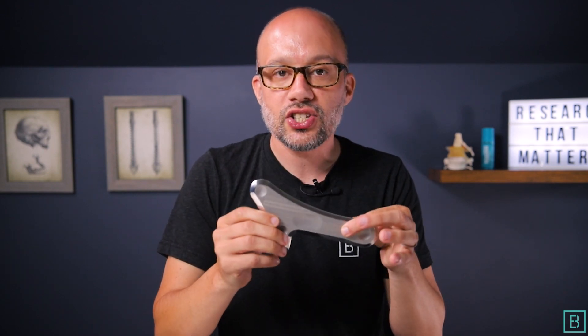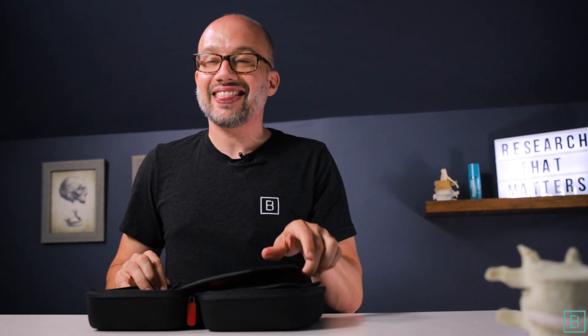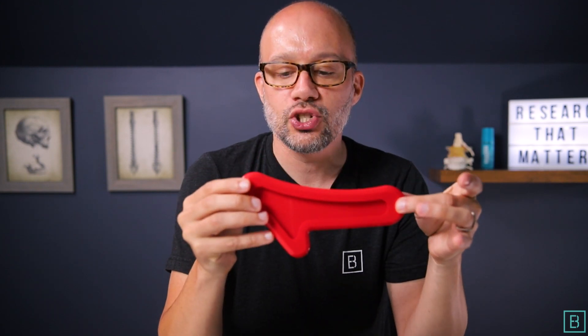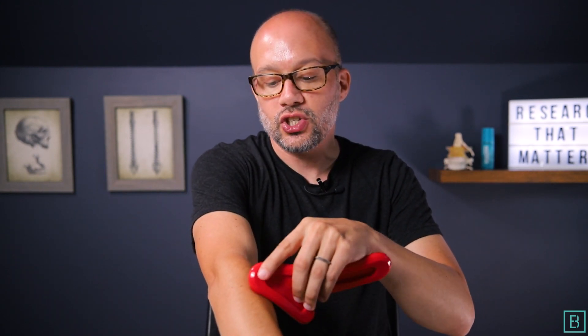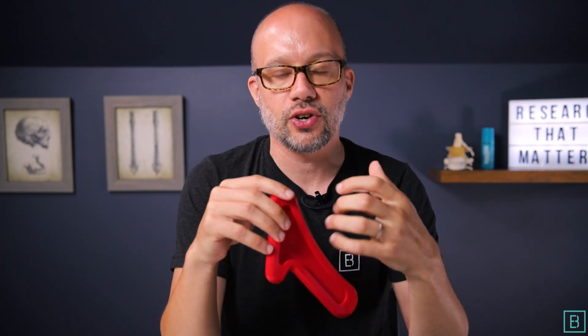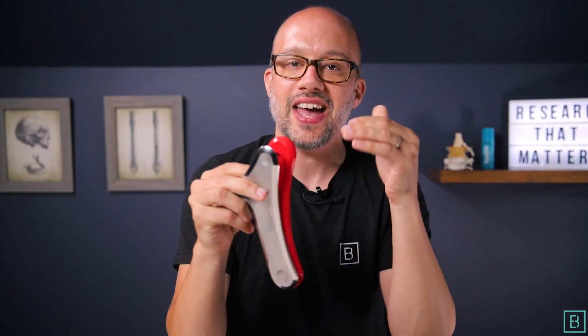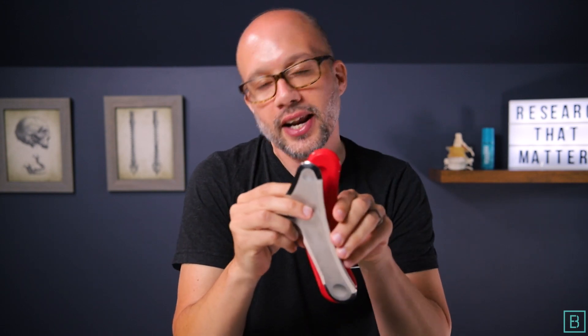Now, surgical stainless steel is awesome, but there are times where you might want a different contact point — something else that goes into your application of soft tissue. That is where the two attachments come in so handy. One of them is a silicone sleeve. This slips right over the top of Mohawk, and what it enables you to do is really grip into the tissue. If there's an area where you want a little extra grip and additional traction, the silicone sleeve slides right over the top of the instrument and gives you that extra grip.